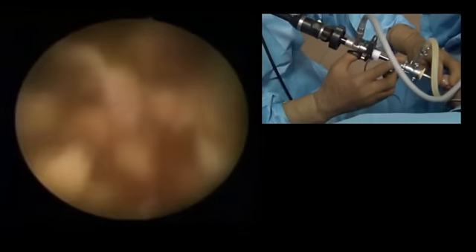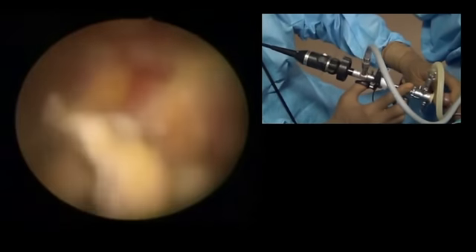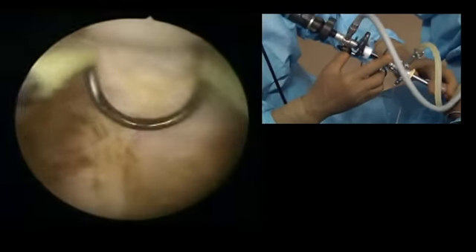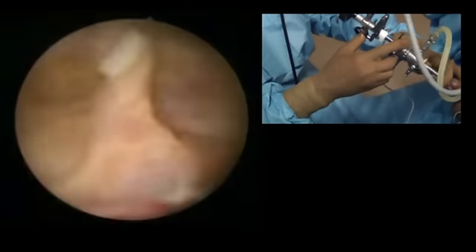While you are resecting, in between you should go into the bladder lumen, come back into the fossa, and go into the bladder lumen in between to drain the bladder a little bit. Otherwise the bladder may become overfull and you will never know about it. The chips are pushed back into the bladder lumen and we later retrieve them — I will show you the way to retrieve the chips.